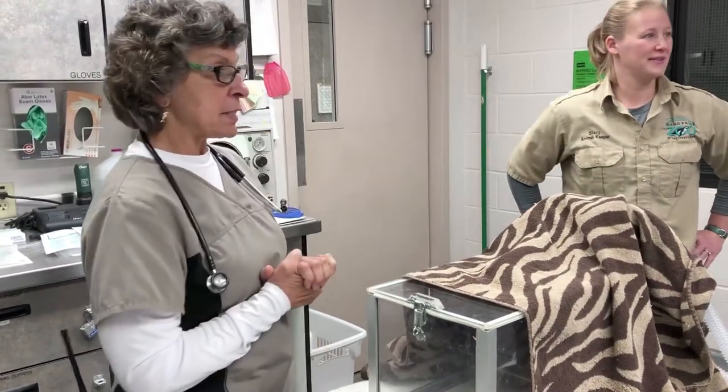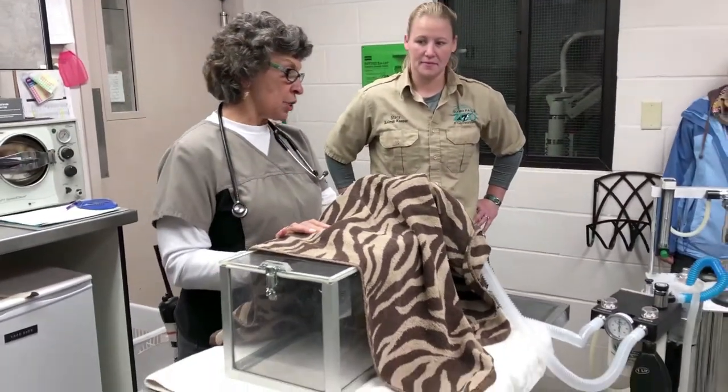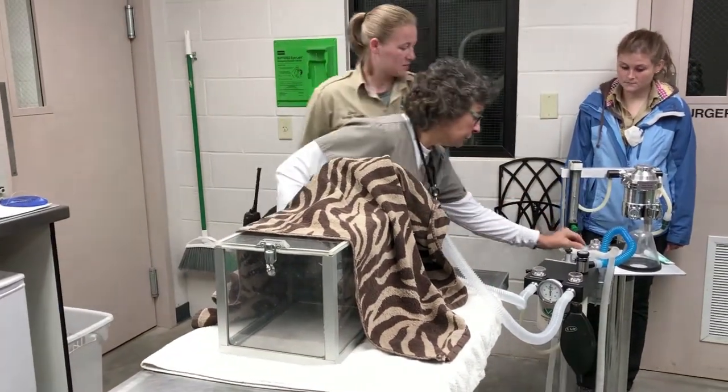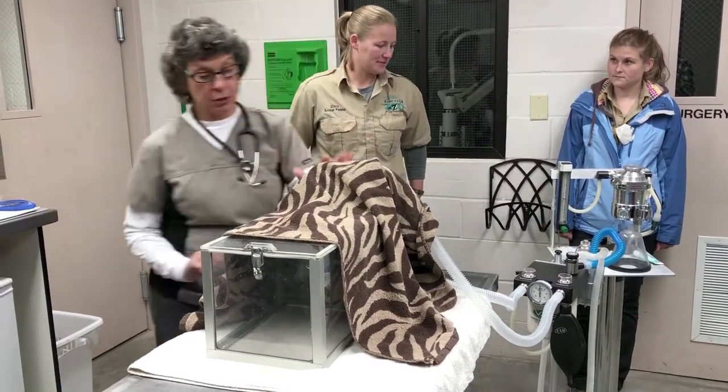We're just going to let her go to sleep. The anesthetic is running through there. This is called an induction chamber, so she's just going to sit here and breathe it, and then she'll go to sleep. We use a small mask to place over her nose, which gives her the anesthetic, and then we look at her teeth.